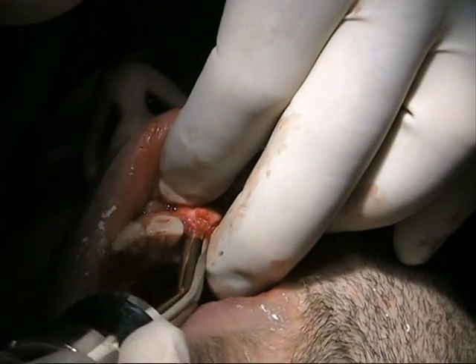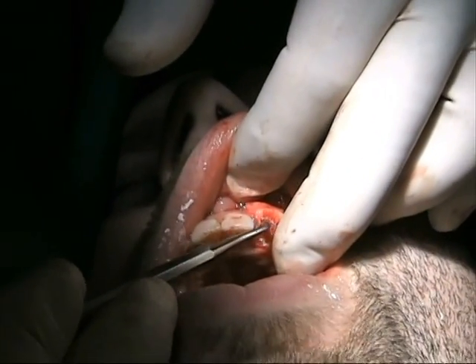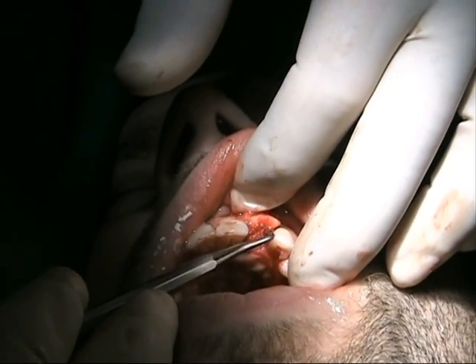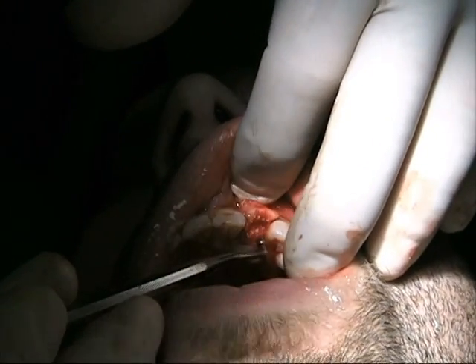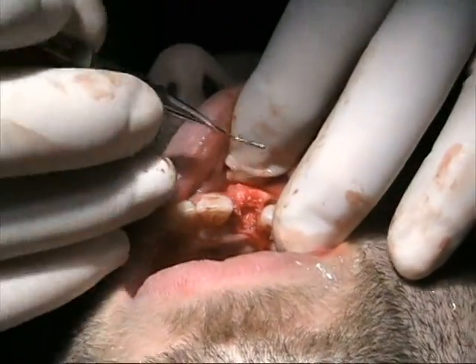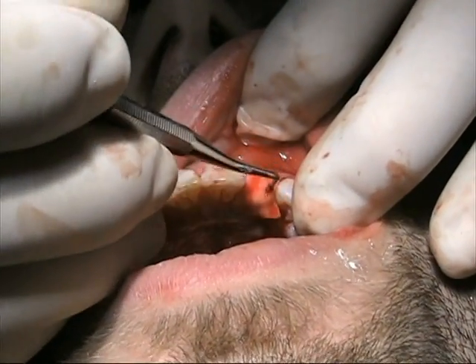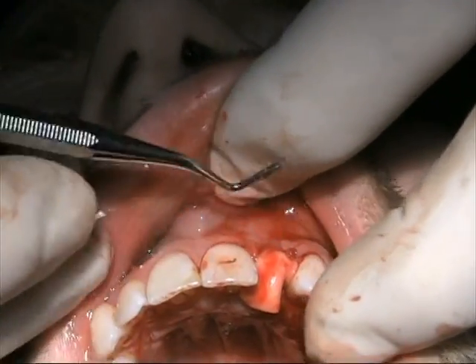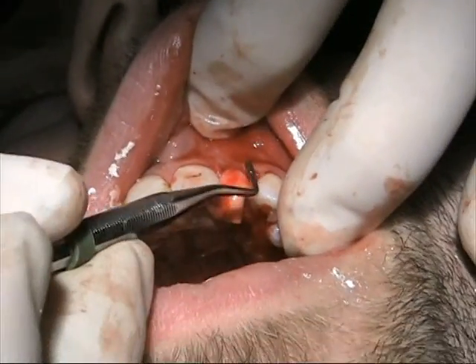The DynaGraft 2 has the advantage of becoming at body temperature a little more firm. So we can hydraulically compact that with an instrument such as an amalgam condenser if you so choose. You'll start to see how the facial mucosa is starting to fill out as we pack this in. We'll now be able to rotate the flap and tuck it in on the lingual aspect where I have already created a space for this flap to tuck under. You can see by virtue of that hydraulic compaction the natural curvature and anatomy being restored to the facial mucosa.